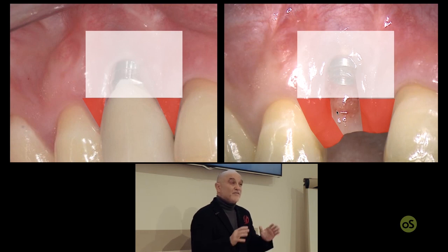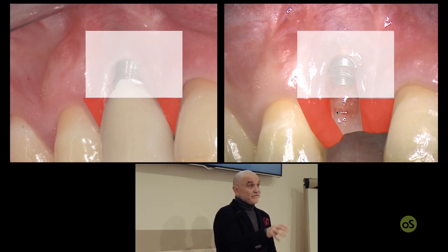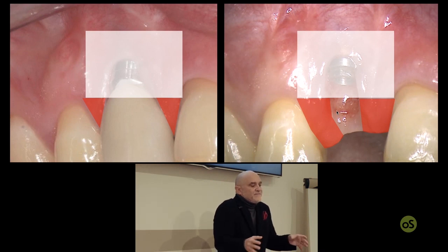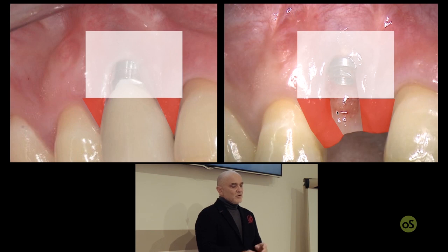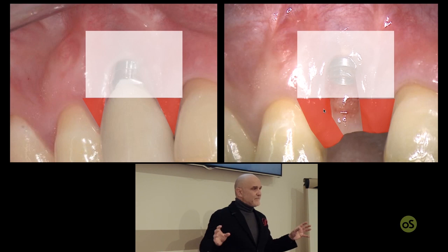And before saying that there is no way to treat an implant and to cover an implant, you have to make the pre-surgical phase. This is called the pre-surgical phase. Remove the crown, change the abutment, apply a short temporary crown, and leave the tissue to fill the space, because if this tissue becomes papilla that can be extended in its desepithelialization towards the palatal aspect, now you can really more predictably cover your implant, independently of the bone peaks, independently of the bed or the buccal malpositioning.